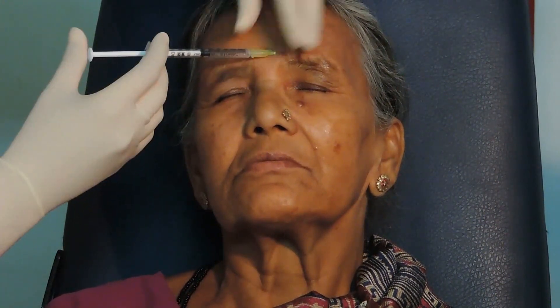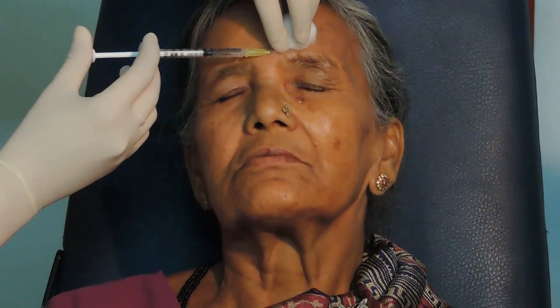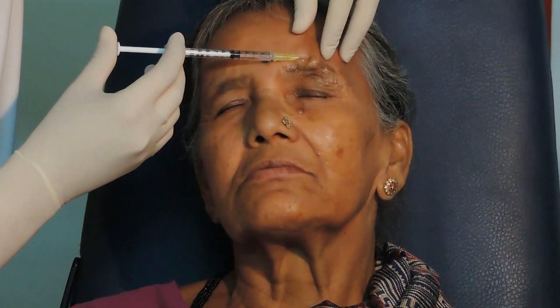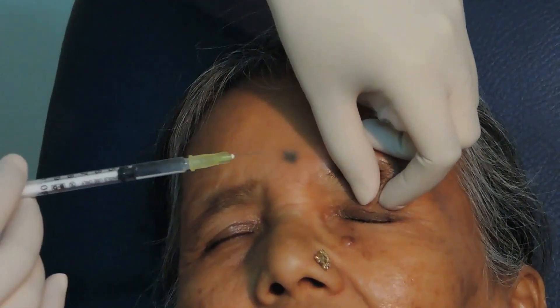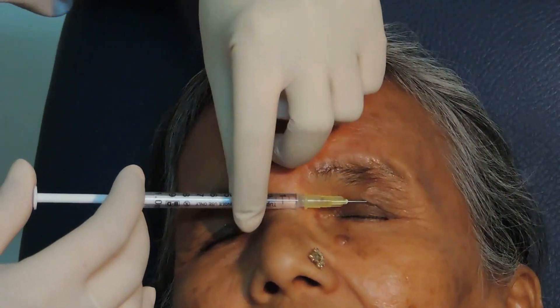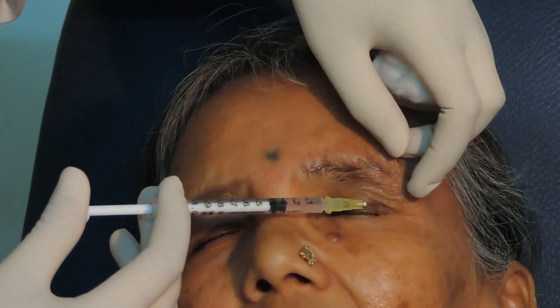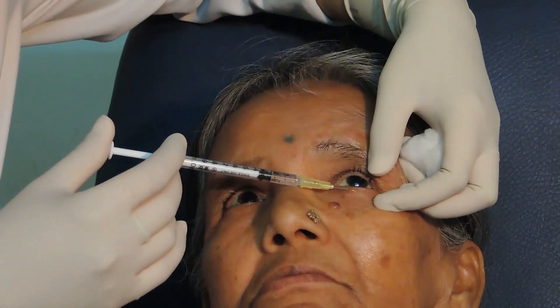Using a 30-gauge needle, 2.5 units of botulinum toxin is given at the glabella targeting the procerus and the corrugator superciliaris. 2.5 units above the eyebrow into the orbital part of the orbicularis. 2.5 units subcutaneously into the upper lid in divided dose, and 2.5 units to the lower lid centrally and laterally.